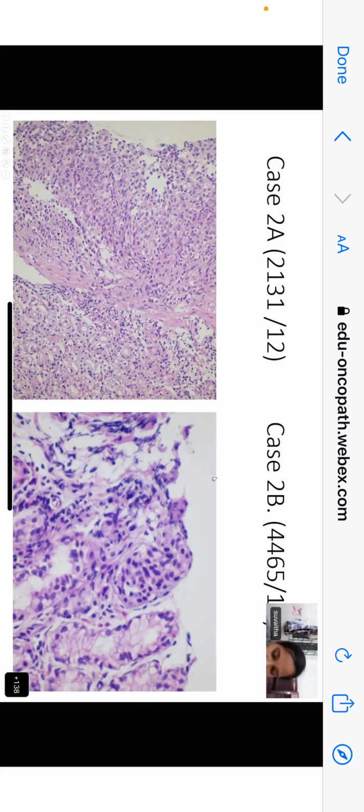Now, Suveta, what are you seeing here? On the left side, I can see the muscularis propria. Sorry, muscularis mucosae, ma'am. And there are few glands beyond the muscularis mucosae. Can you please mark the few glands beyond the muscularis mucosae? They're not glands, ma'am. They're cells beyond the muscularis mucosae. I think there is no glandular arrangement. You just have to make a good description, okay? Not glands. You say where are the glands, and then you say not glands. So make up your mind, Suveta. What are you describing? You can annotate. They are just cells, ma'am.